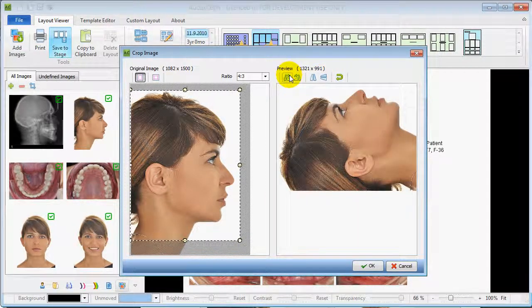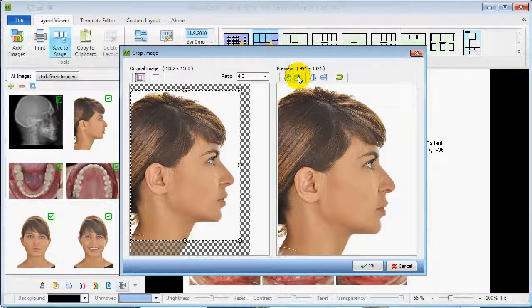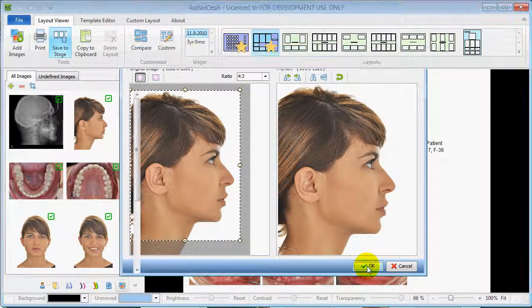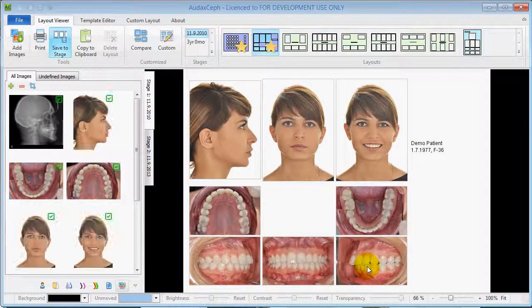When you are satisfied with the result, click OK. This will produce the cropped image.